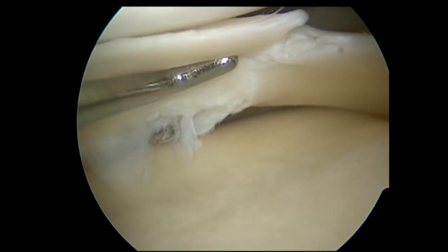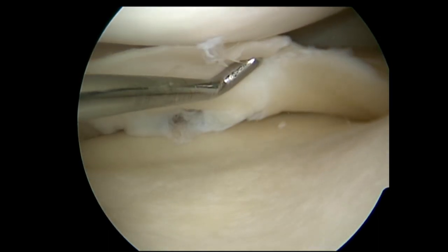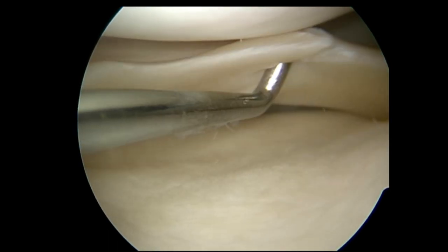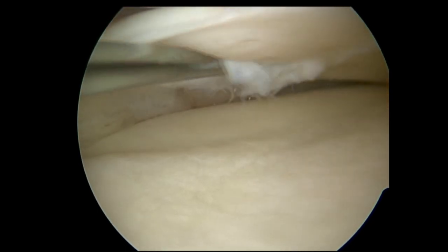Now that particular meniscal tear was in an older patient. The reason I'm poking and prodding it for a while is to get a really good feel for how extensive the tear is, whether it's a simple tear, whether the tissue's degenerate, whether it's likely to be repairable. And that's largely an intraoperative decision. You can get a pretty good idea beforehand as to the probability of whether a tear's repairable, but a lot of the time you don't actually know for certain until you get in there.